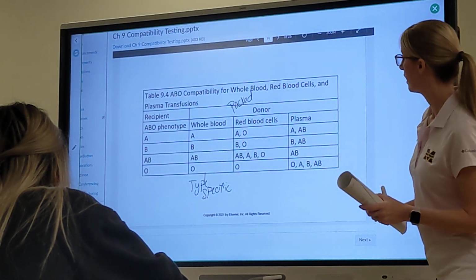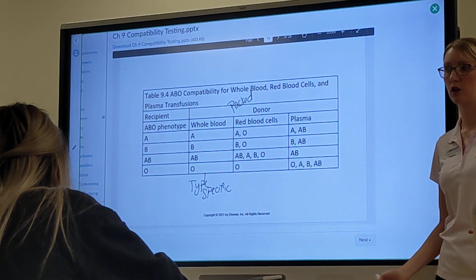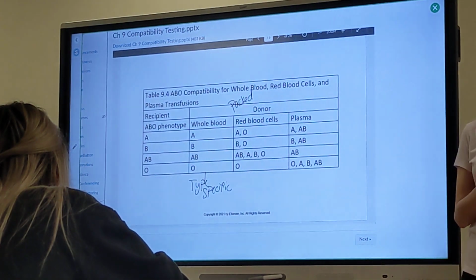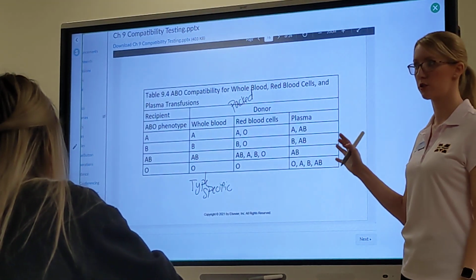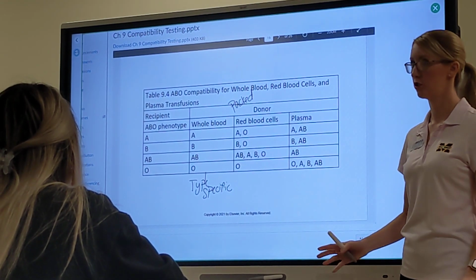And so they're using blood at an alarming rate. They've already gotten 6 units of your O blood. What are you gonna do? You're gonna type them as soon as you can, and if they're an A, you're gonna switch them. The goal is to not deplete your O's. So as soon as you determine their blood type, which you really need 2 determinations, once you get that, you're gonna switch them.